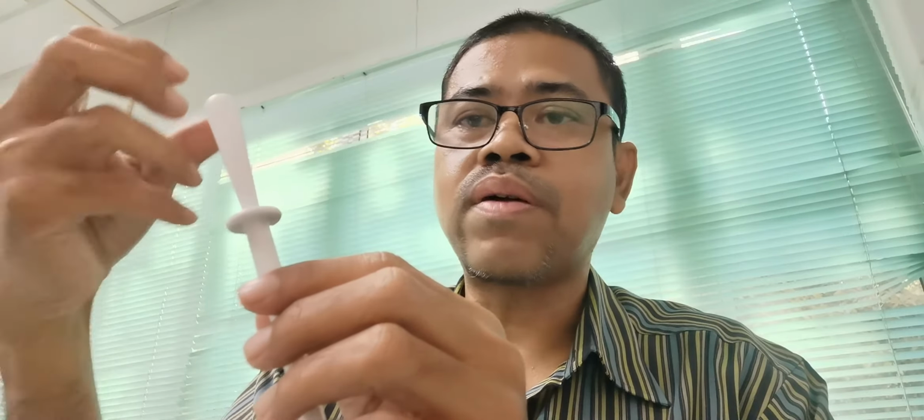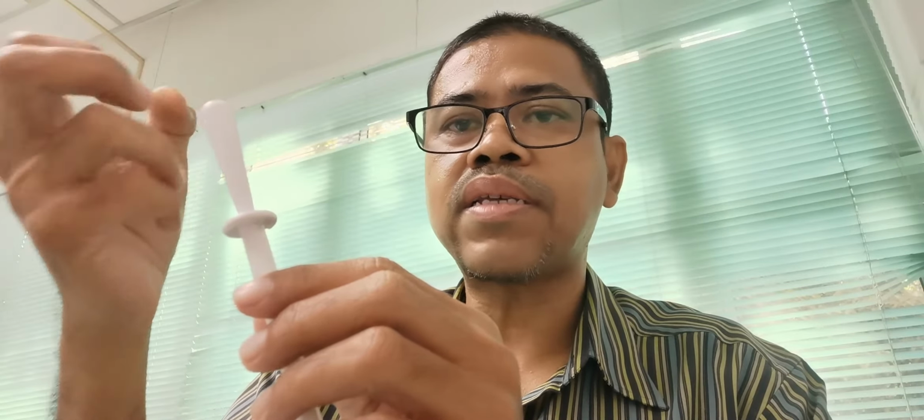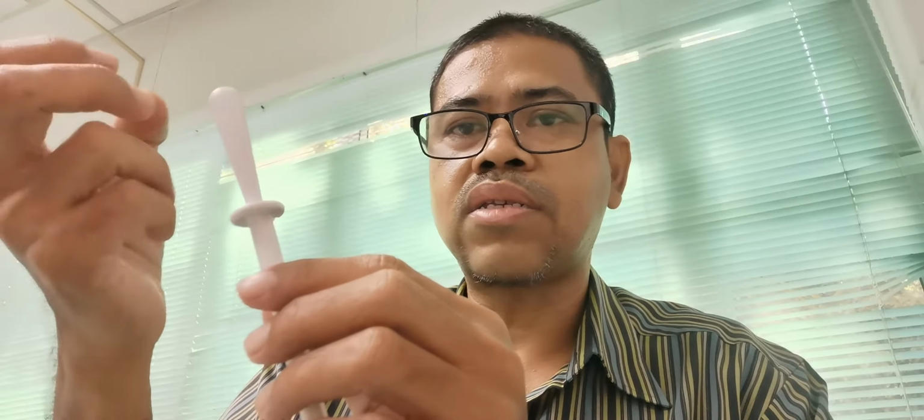The traditional suprapubic catheter basically comes as a hard plastic catheter, size 12 or size 16. The technique is still the same. When you see the urine out, you take out this thing and introduce the suprapubic catheter, which is smaller than this, and there are markers. In that situation, the catheter has no balloon.